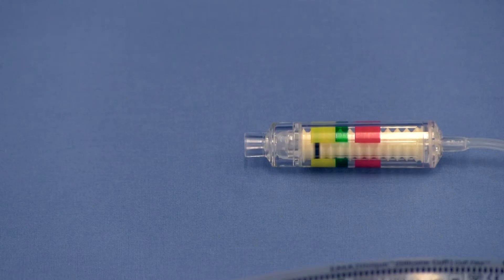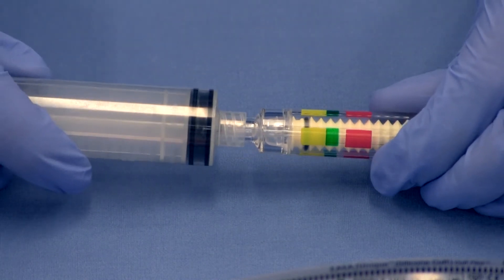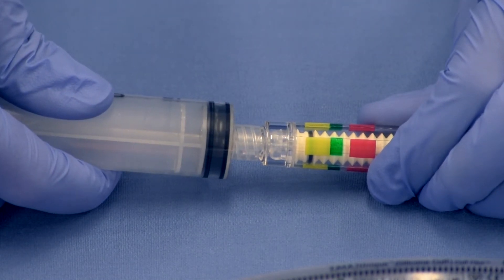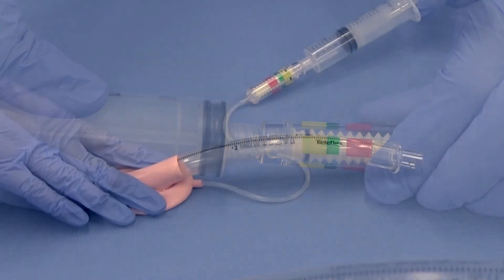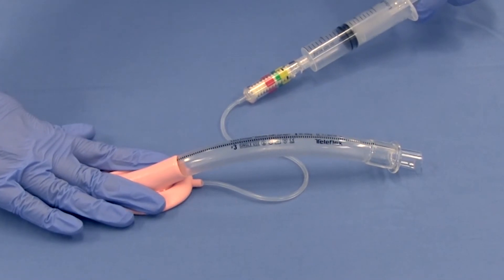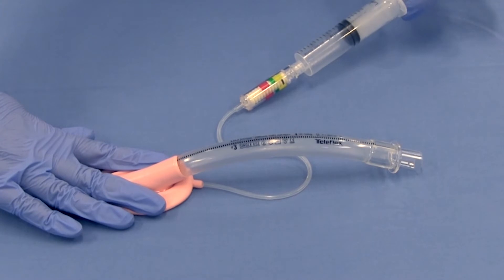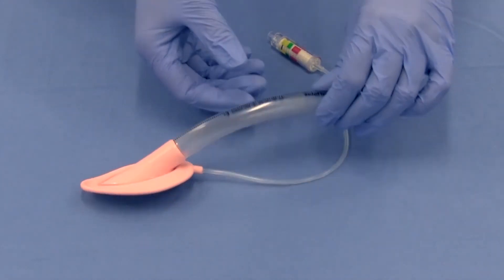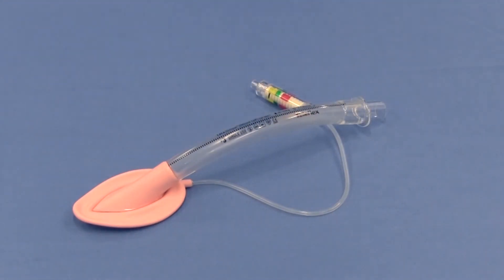To deflate the LMA airway with Cuff Pilot Technology, push and turn the syringe to firmly connect the syringe to the inflation port. Ensure that the tip of the syringe is inserted far enough that it makes contact with the silicone valve within the cuff pilot valve. Deflate completely in order to create the stiff, thin leading edge necessary to wedge the tip behind the cricoid cartilage. The cuff should fold back away from the aperture bars. Disconnect the syringe from the inflation port.